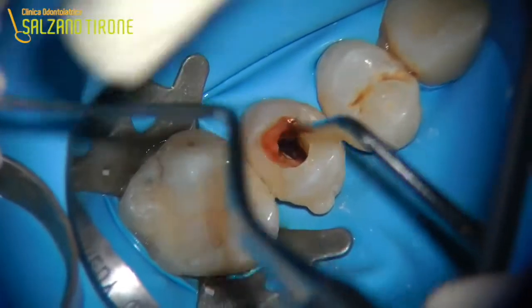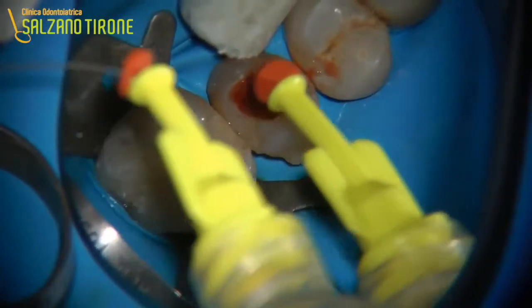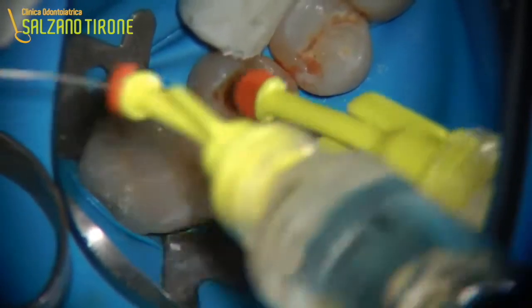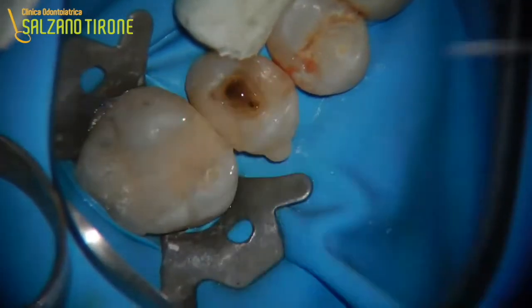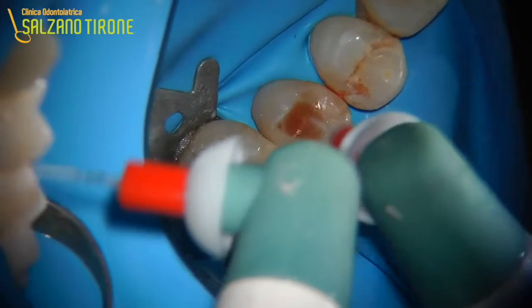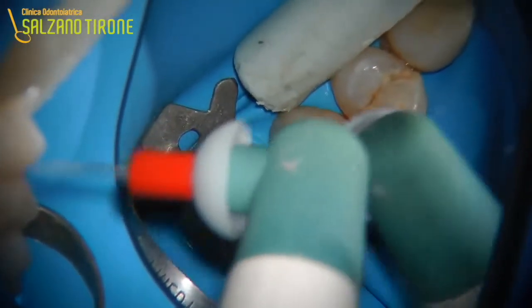From here, getting to that area is absolutely not complicated, nor far, nor unreachable with a microscope. The first phases of this kind of intervention are always a little hectic, because even if you were expecting to find some bleeding tissue, when you get there it's a big mess. Everything starts bleeding, you feel frustrated because you think you are dealing with an impossible to recuperate tooth, you scratch here, rub there, even what you thought could never bleed starts bleeding instead. Overall, the whole experience is somewhat traumatizing, since you witness bleeding in a part of the tooth which isn't supposed to bleed at all.